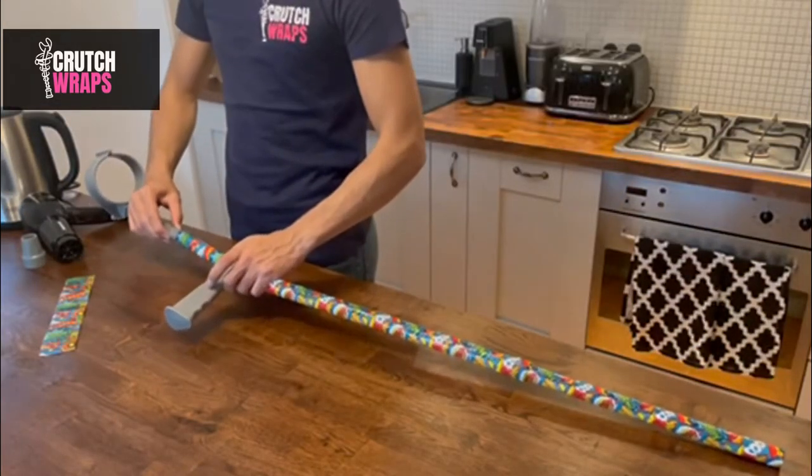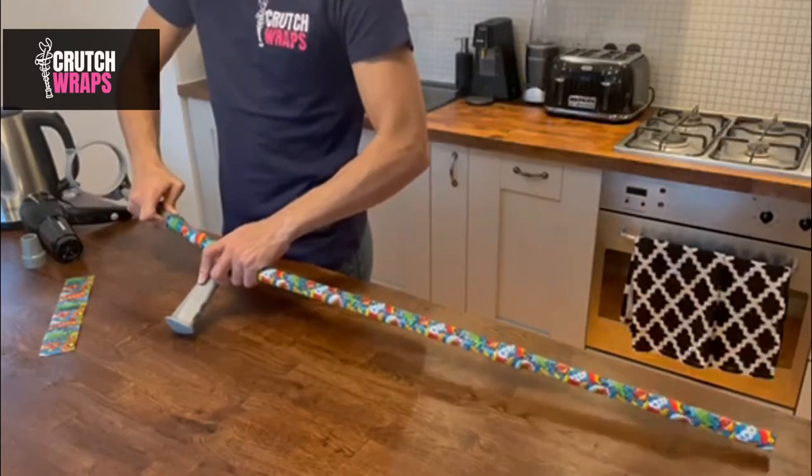Reattach the armrest and measure how much of the wrap you will need to complete the lower part of the armrest.